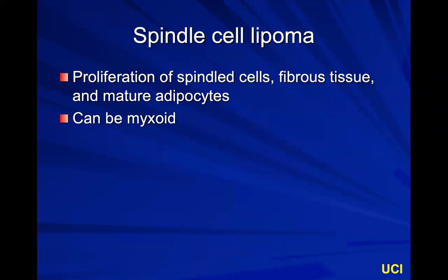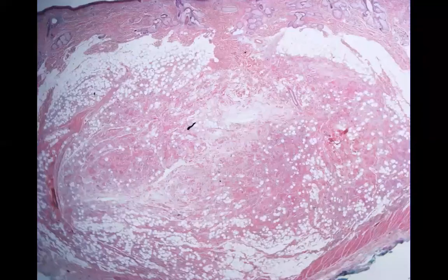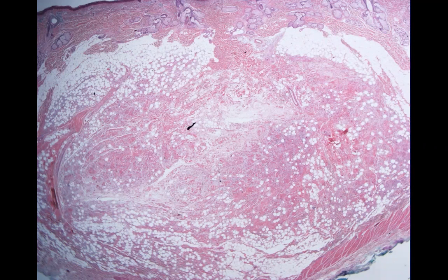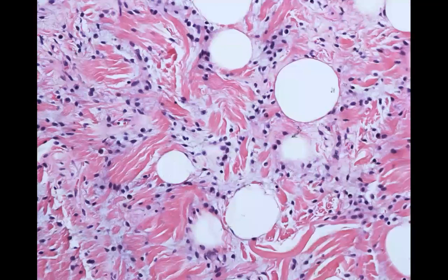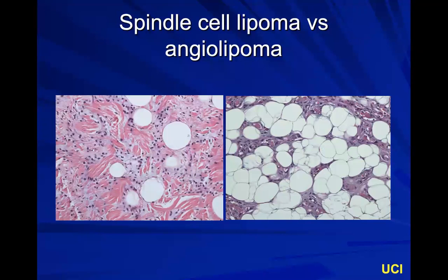A spindle cell lipoma has a proliferation of spindled cells with some fibrous tissue mixed among the mature adipocytes. It can also be myxoid. These spindled cells are of uncertain identity — possibly fibroblastic or precursors to adipocytes. CD34 would stain both. In the image, even though it's very cellular, you can see adipocytes scattered throughout hinting it's a fatty tumor. The spindled cells are not forming blood vessels, and the bluish background is the myxoid stroma. A side-by-side shows spindle cell lipoma versus angiolipoma, where cells are endothelial and form blood vessels.